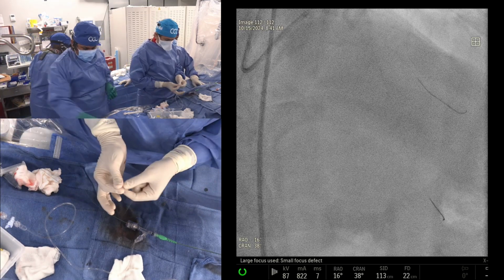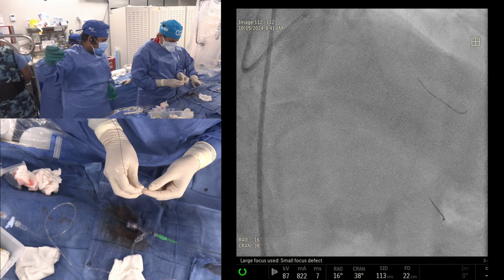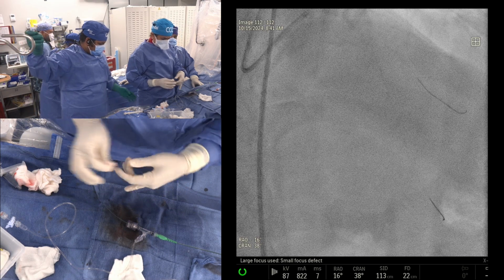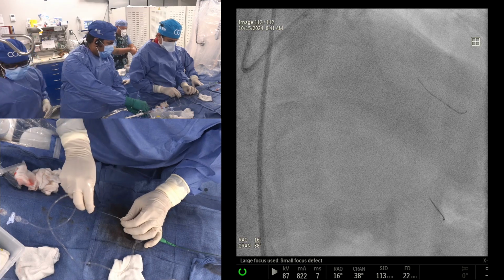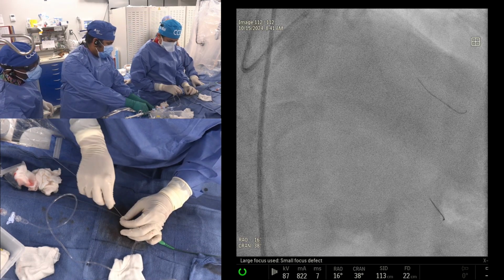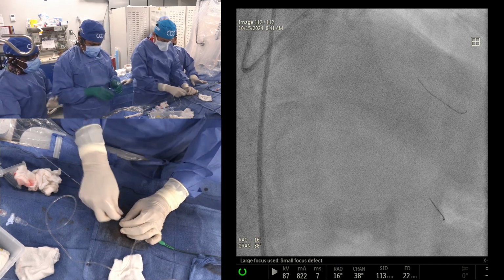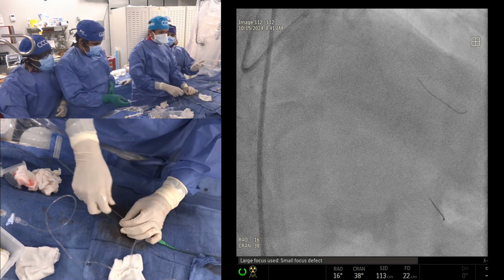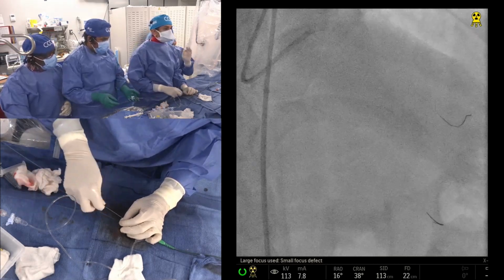So, Samin, another question has come, and I'll quote it exactly as it is: why the rush to remove the right contralateral catheter? The question is about the utility of the catheter now. Your wire is very nice and you have good antegrade injection. So if you leave the catheter, there is always a chance you make thrombus, some little clot on the tip.